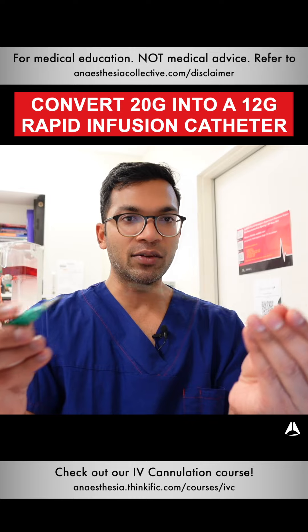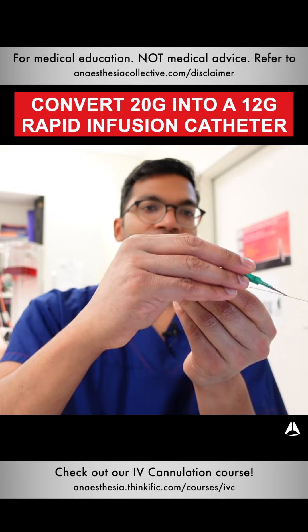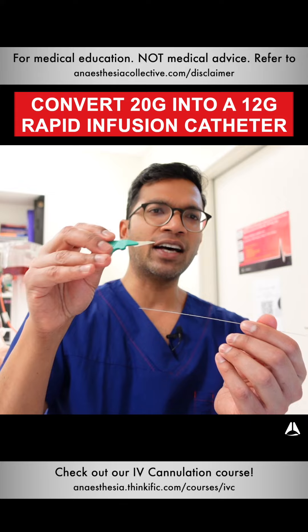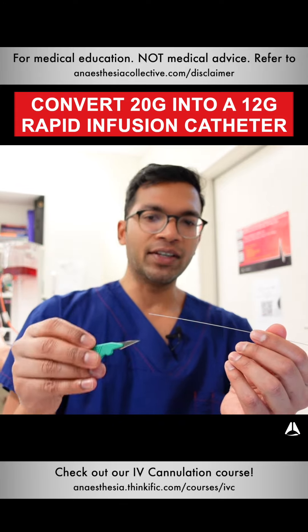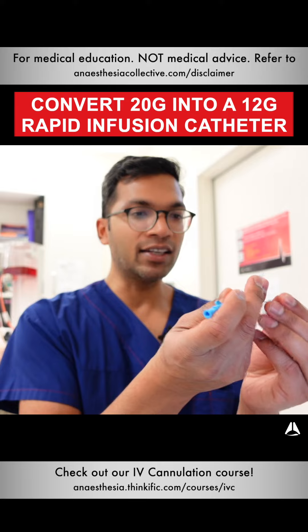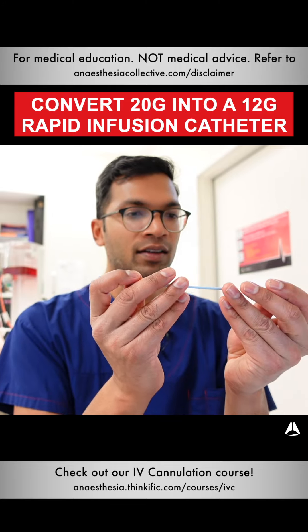I cut the skin next to the wire — I make an incision just near where the wire is, alongside the wire. Now I've got more of a cut that allows me to put the dilator and cannula, or rapid infusion catheter, in.